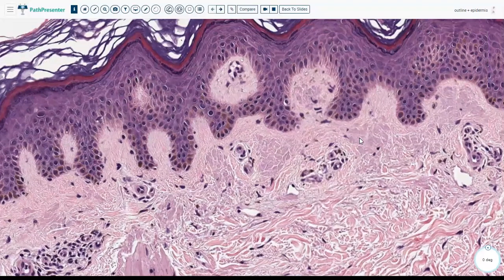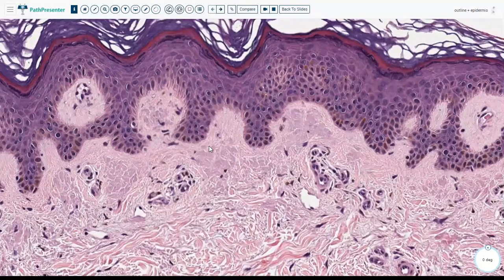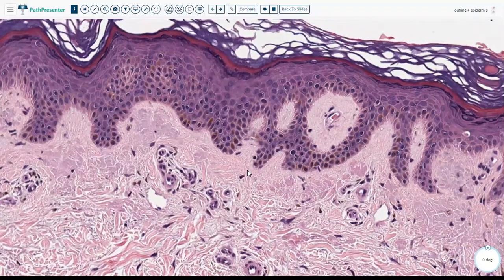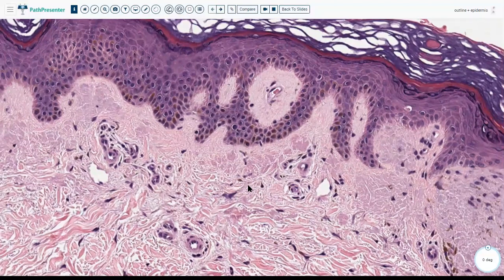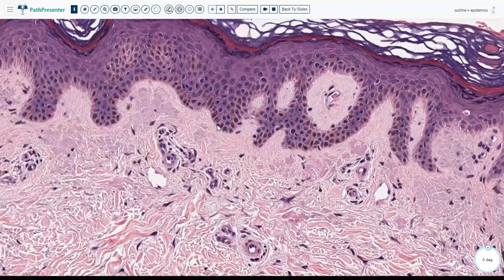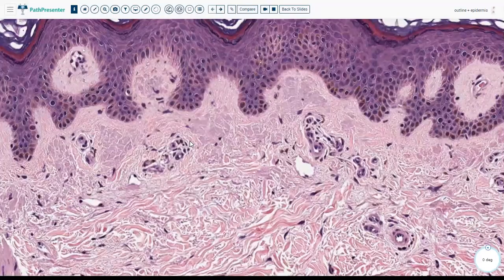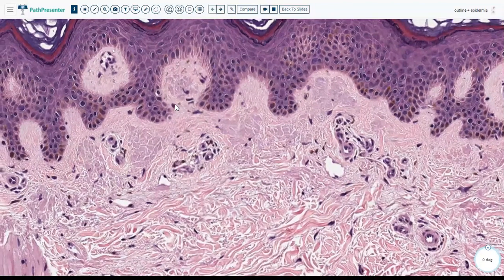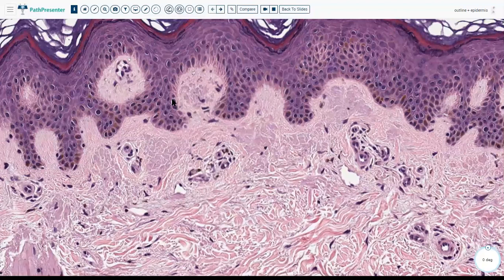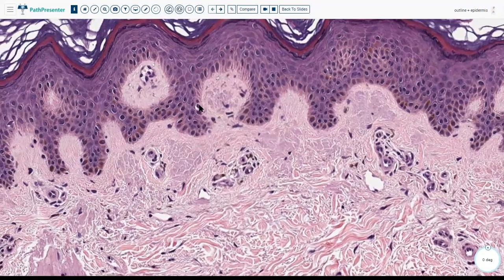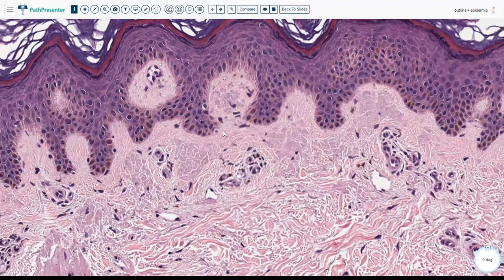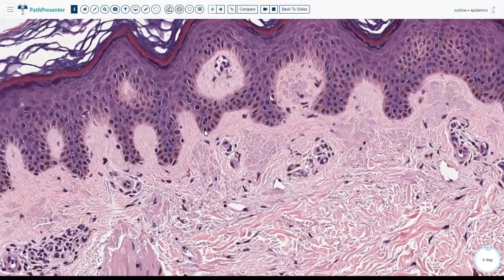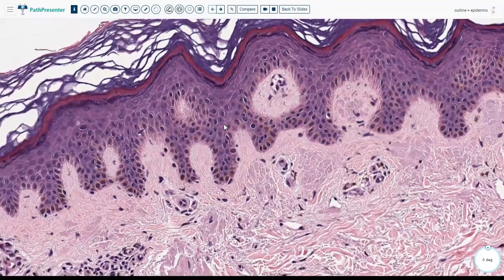Another feature that might be less reliable, but also helpful sometimes, is which cells are pigmented and which are not. The ones you usually see pigmented are most likely keratinocytes. The ones that are usually not pigmented are the melanocytes — because, as Walter White says in Breaking Bad, suppliers don't use what they produce. They just supply and make the melanin, but don't use it.